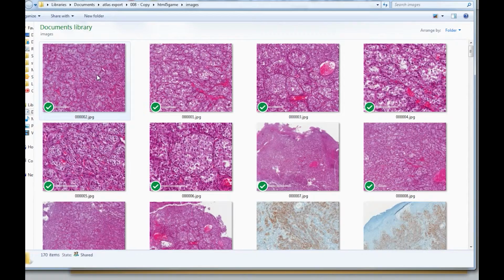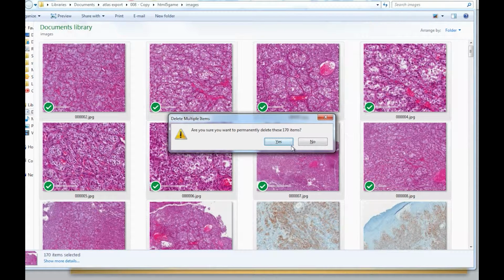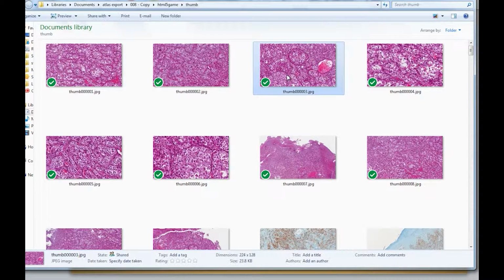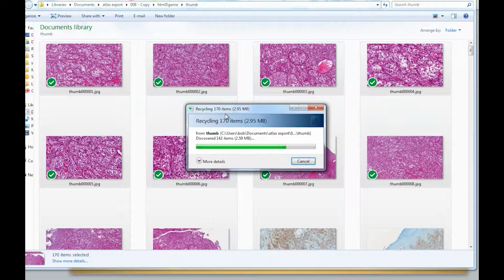You want to make your own atlas, so first you need to delete our content from the Atlas app. To do so, delete all the image files in the images and thumbs directories. Don't delete the actual folders, just the contents.